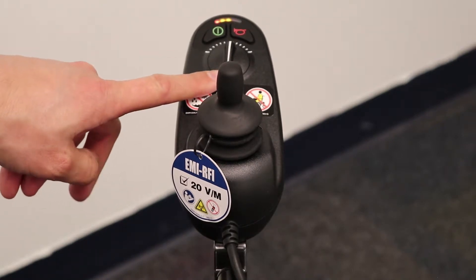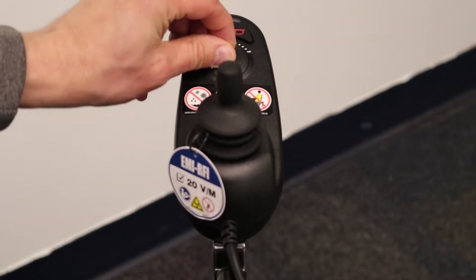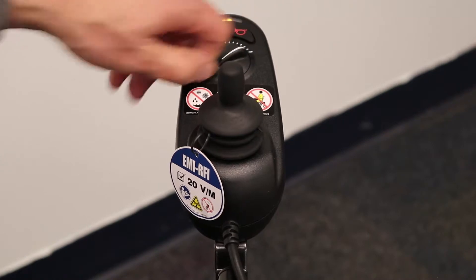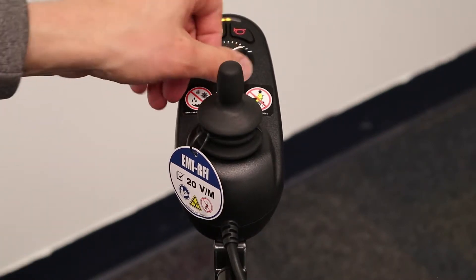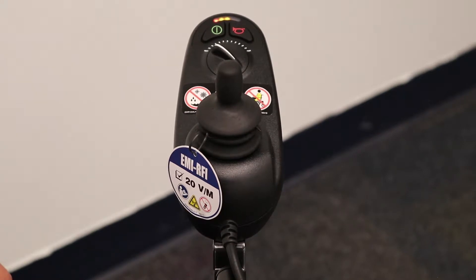The speed dial is a turn dial. Once you turn it all the way to the left, it will be set to the slowest speed; all the way to the right, and it will be set to the fastest speed. We recommend using it on the slowest speed until you become comfortable with the operation.